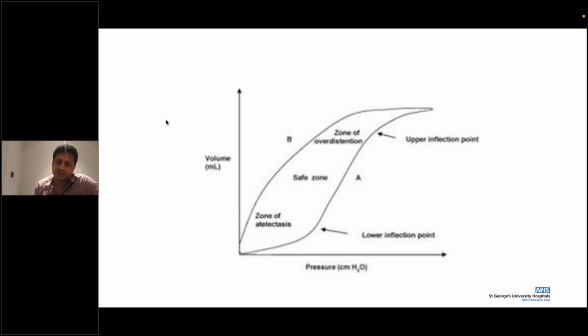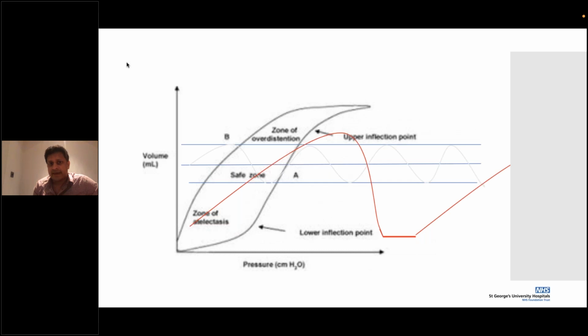Then high frequency mode of ventilation actually serves as a very good mode of ventilation, because the targeted tidal volume over here is anywhere between 1 to 3 mL per kilo. What we're doing is giving sudden bursts of continuous oscillation to the baby, and it works slightly, ever so slightly, in a different fashion. So instead of the pressures going all over the place, you'll aim anywhere between 1 to 3 mL per kilo, and it'll still be in the safe zone, and that would be the idea for high frequency ventilation.